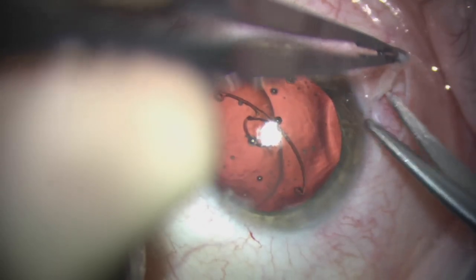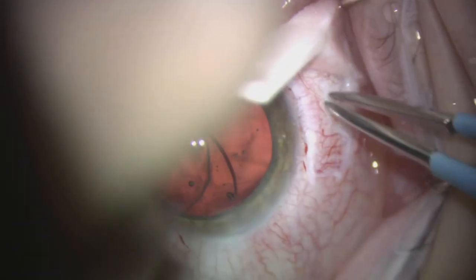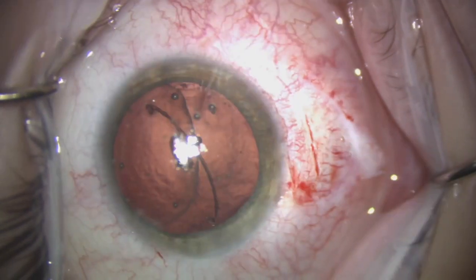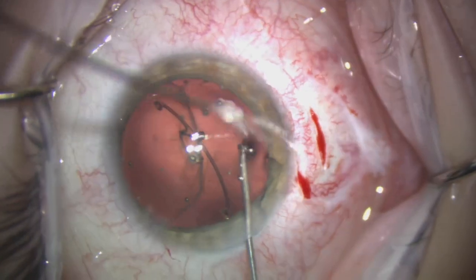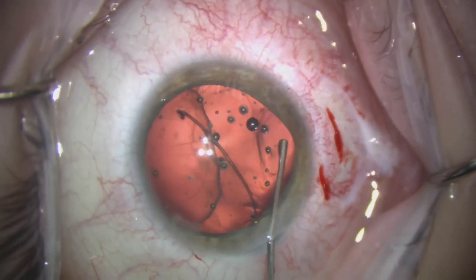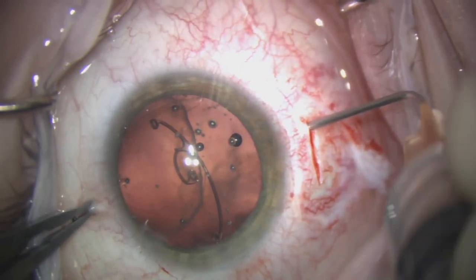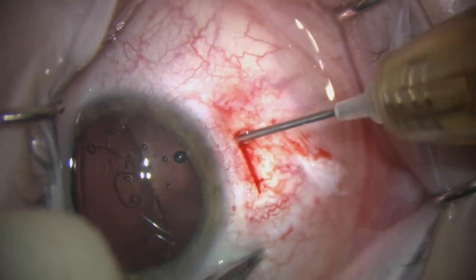We start by opening up the inferior conjunctiva. We proceed with a little cautery to the sclera, then make a groove a couple of millimeters back from the limbus. This groove will be used to pass our 25-gauge needle in order to exteriorize the Gore-Tex suture. A little more viscoelastic here to push back the anterior hyaloid once again. We then use a bent 25-gauge needle to create a track into the eye.